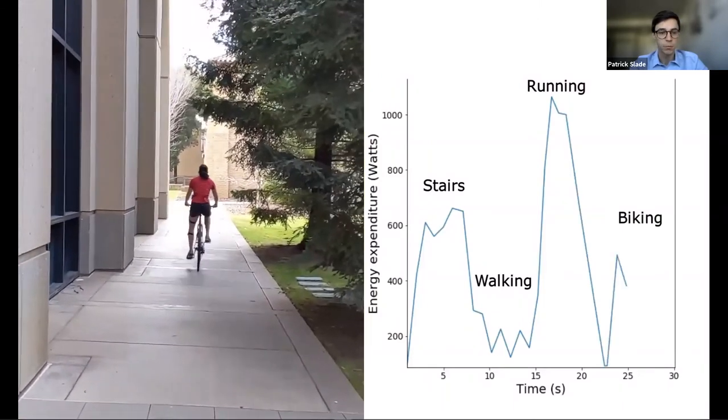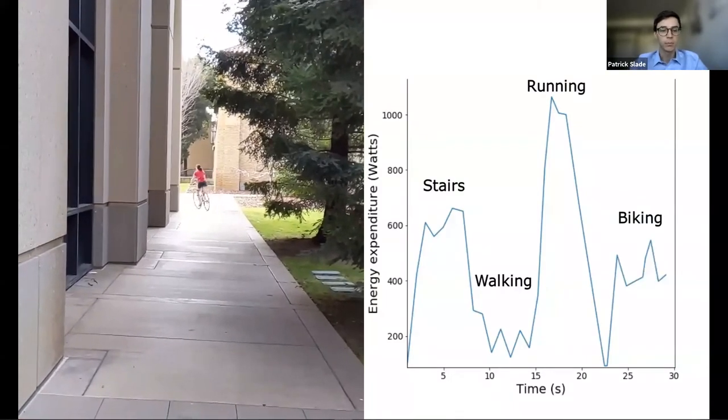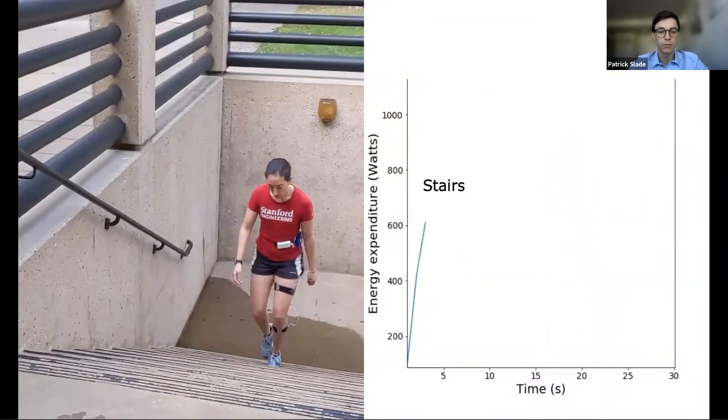And so this kind of illustrates the point that we've been talking about before, where relating this leg motion to energy expenditure is quite effective.